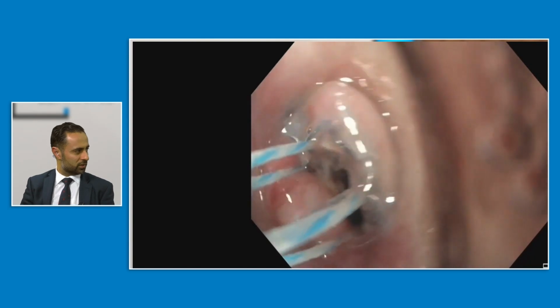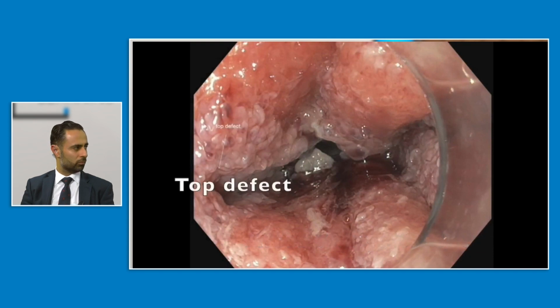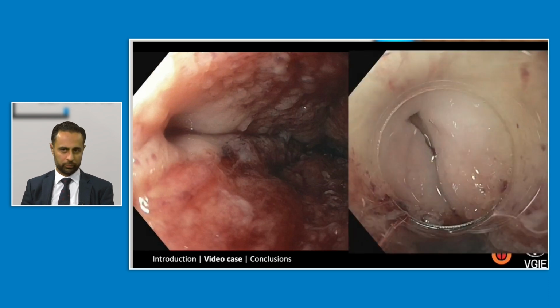What's your thoughts on this device, Ryan? Do you see a role for it? Yeah, I think it's really interesting. Negative pressure tissue healing has been used in a lot of other disease states. I think there's a few reflections here. There is no data yet on this at all.